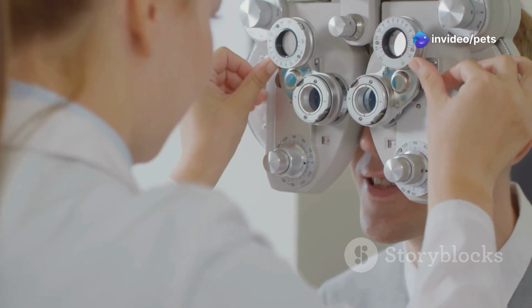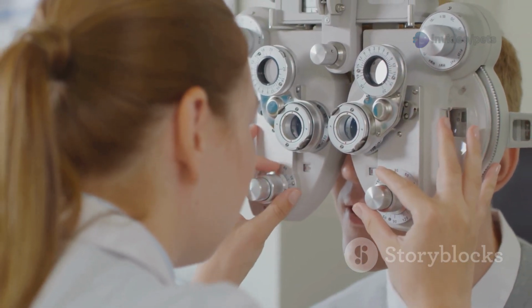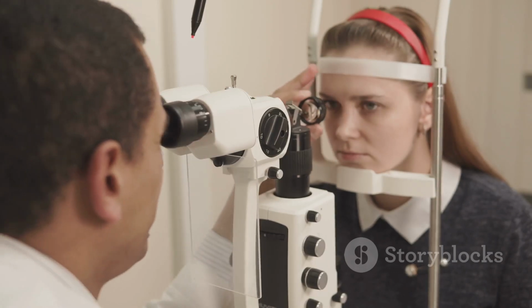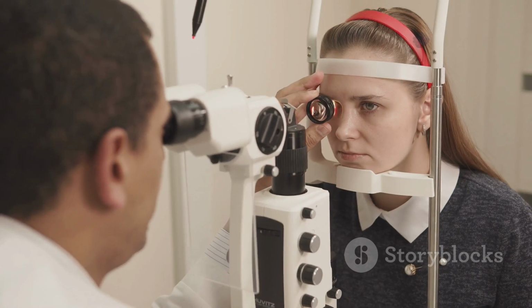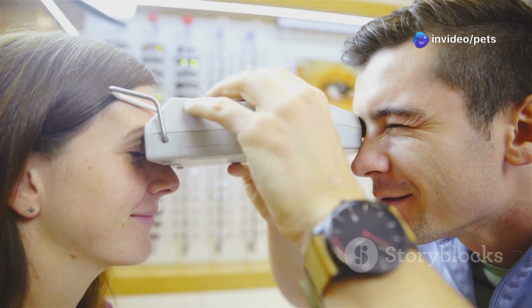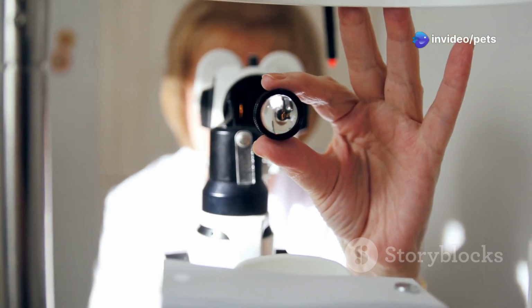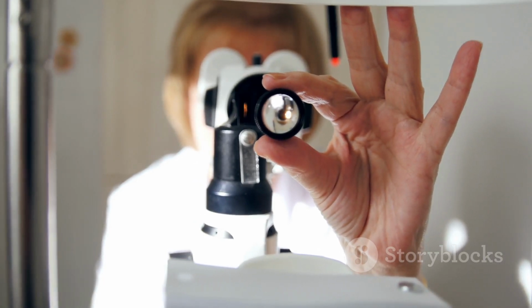Gross retinoscopy is the initial measurement taken during a retinoscopy examination. It involves determining the lens power required to neutralize the movement of the retinal reflex at a specific distance, typically at arm's length or about 67 centimeters. This measurement provides a preliminary assessment of the patient's refractive error.